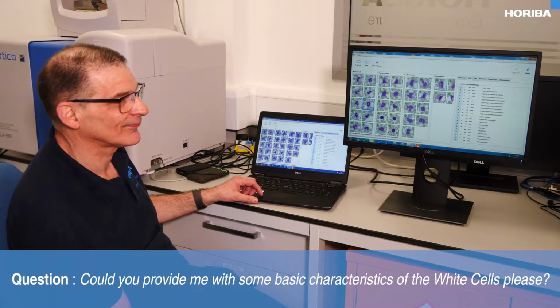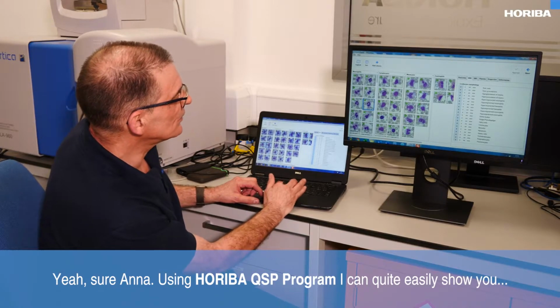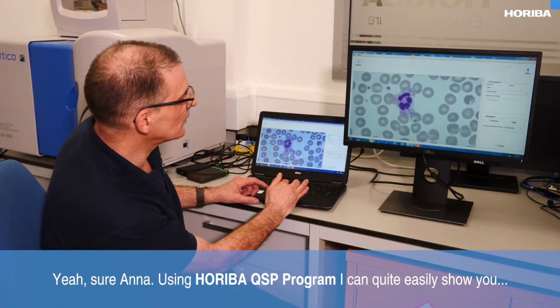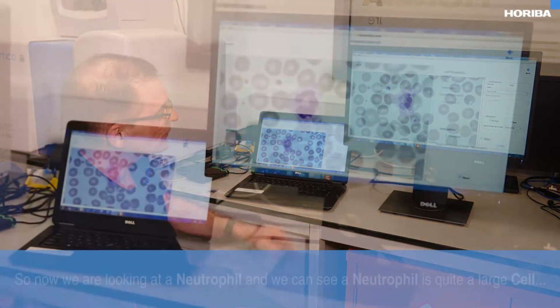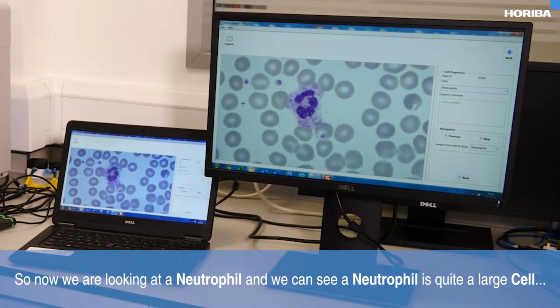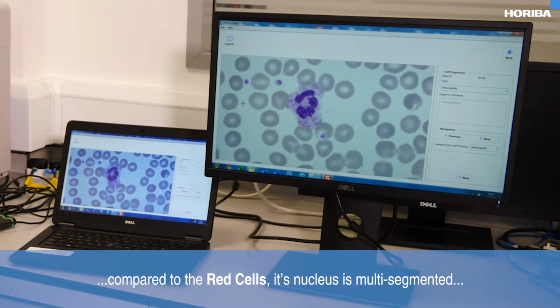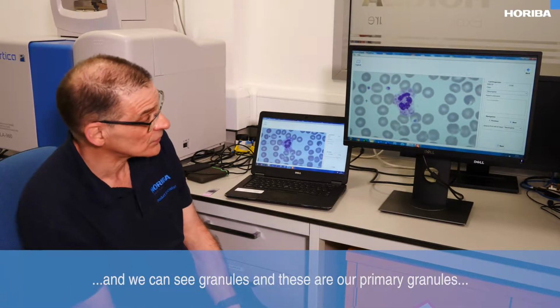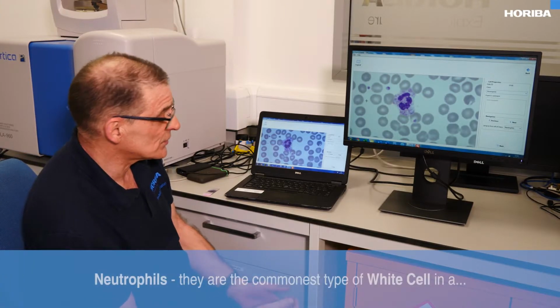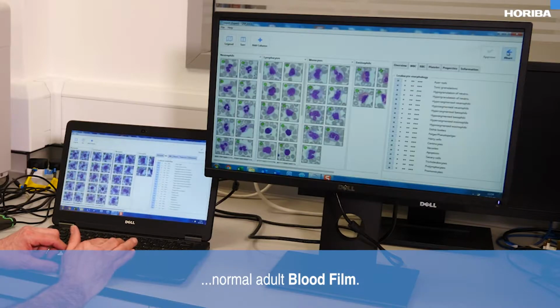Thank you, Andy. Could you provide me with some basic characteristics of the white cells, please? Yeah, sure, Anna. Using HORIBA QSP program, I can quite easily show you different white cells and what they look like in great detail. So now we're looking at a neutrophil, and we can see a neutrophil is quite a large cell as compared to the red cells. Its nucleus is multi-segmented, and we can see granules, and these are primary granules or azurophilic granules. Neutrophils, they're the commonest type of white cell in a normal adult blood film.